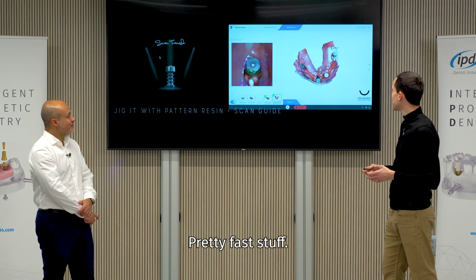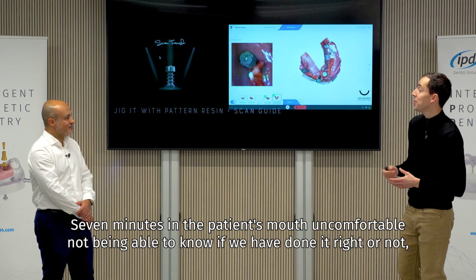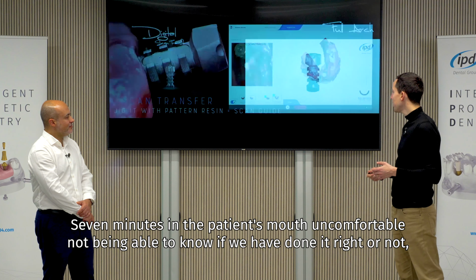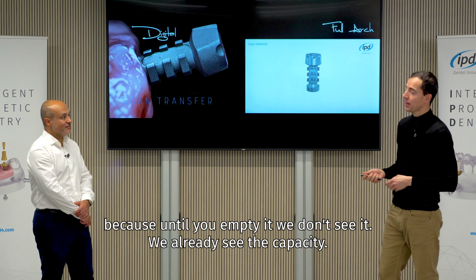Pretty fast stuff. To compare to an analog impression taking with time, with like 7 minutes in the patient's mouth. 7 minutes in the patient's mouth, uncomfortable, not being able to know if we have done it right or not. Because until you empty it, we don't see it. We already see the capacity.